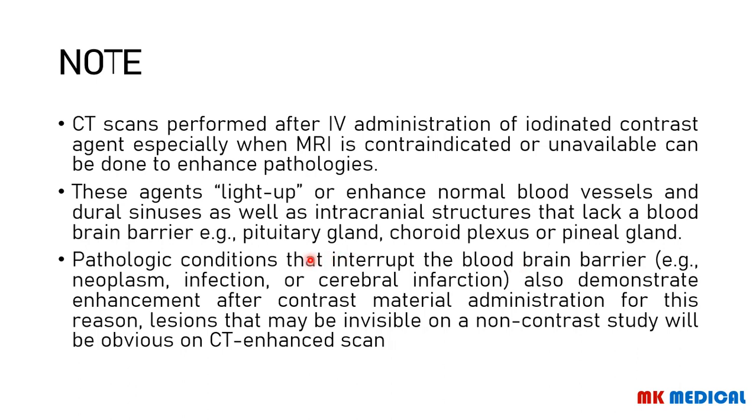So for example, pathological conditions that can interrupt the blood-brain barrier, such as tumors, neoplasms, infections, cerebral infarctions, are going to demonstrate enhancement after you give the contrast material.